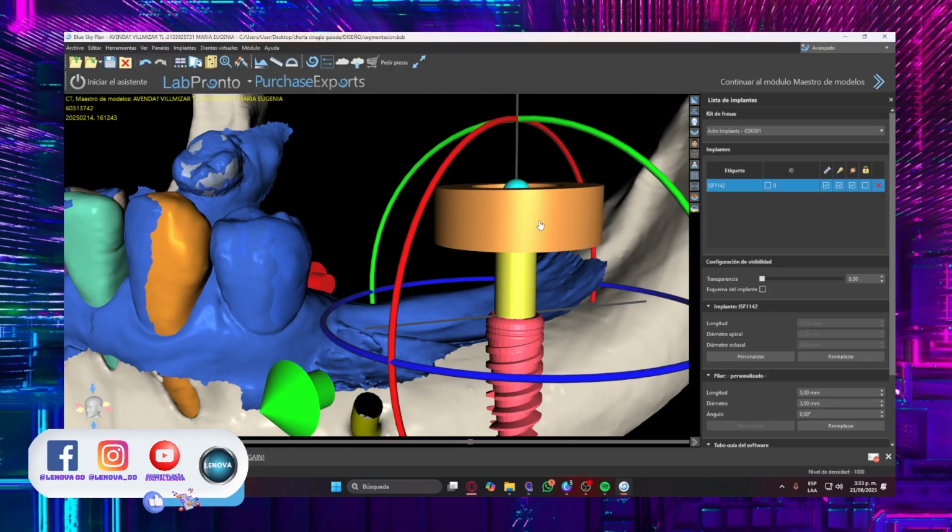That is the reason why the rings of, for example, mine are not useful for placing implants from the inside due to the external diameter, because the configuration comes from here. So it's not just about saying I'm going to make the guide and that's it, but about knowing the entire drilling protocol, how the implants work, what the sequence is.